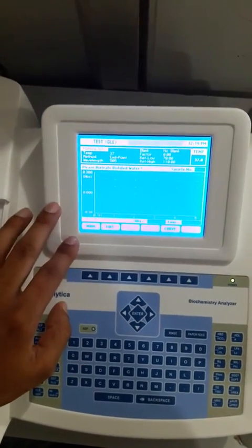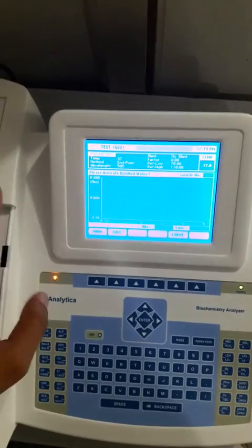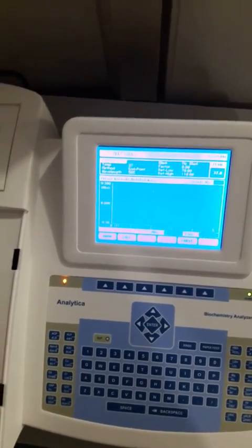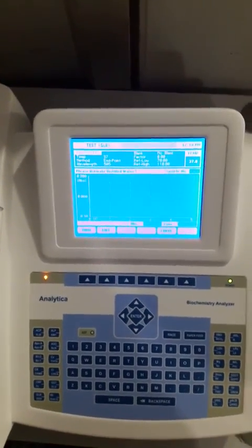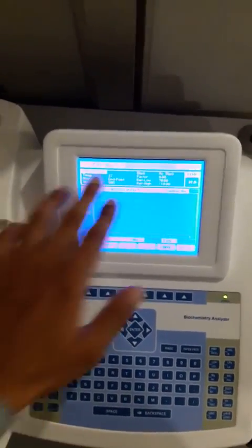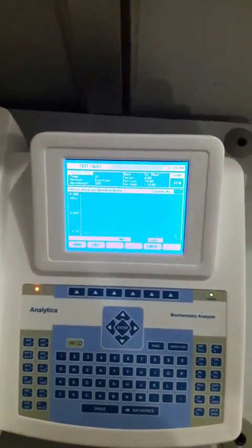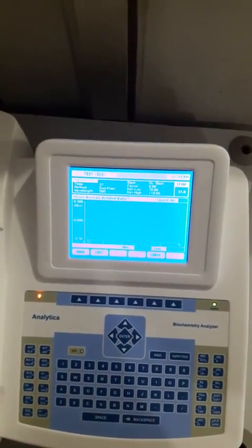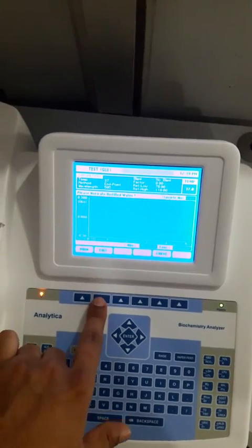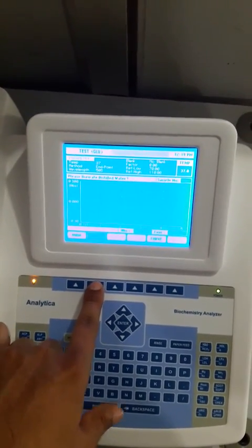Before proceeding further for the test, we have to enter the parameters given in the reagent kit literature. Whichever company reagent we are using, we have to enter these parameters as per that literature. To do that, we have to go to the Edit tag — this is the Edit.